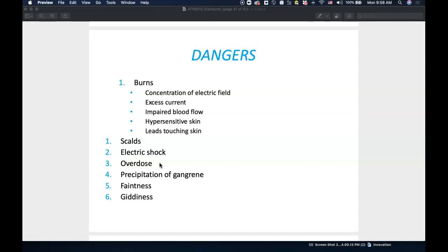I know you guys are probably thinking, but you didn't give us any parameters. So I'm going to try my best to give you parameters, knowing that this isn't something that I use very often in the clinical setting. I can only give you what the science tells me. So, in terms of the things that we are going to be able to adjust on a device, there are two things. It's the pulse width and the pulse rate, right? Or the frequency of the treatment. Does that make sense, you guys?